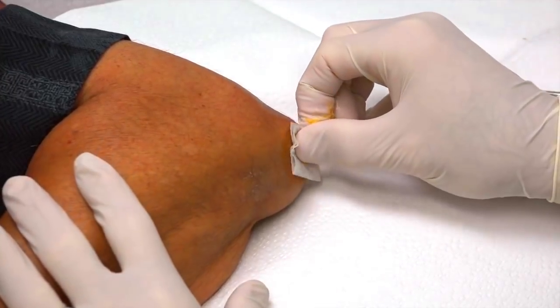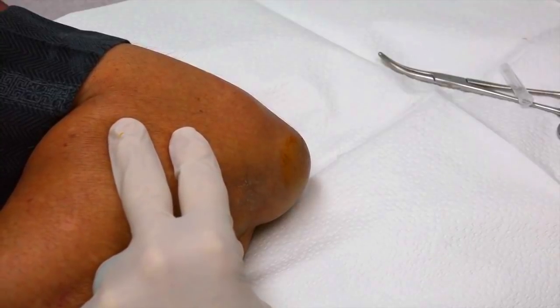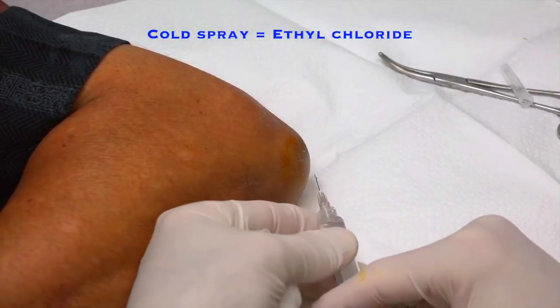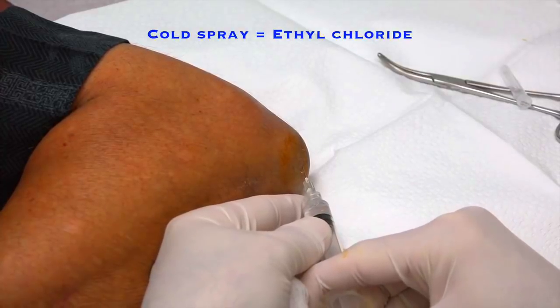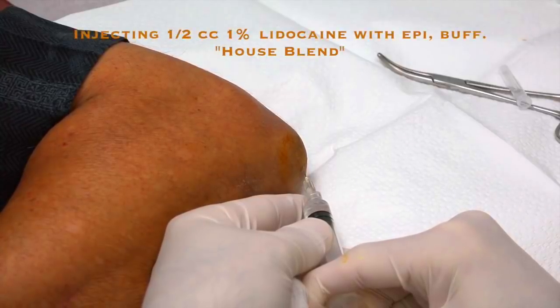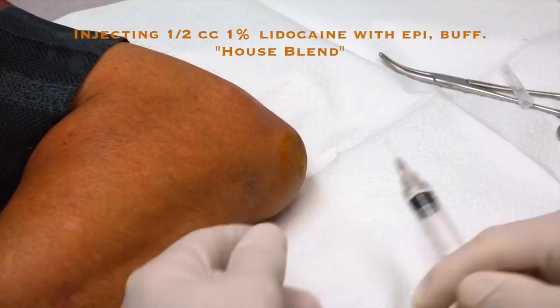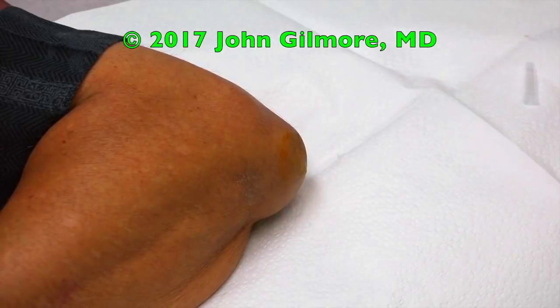Staying active is important, right? Well, we want to do our best to help you stay healthy and active. We're gonna spray a little cold spray on here and go ahead and do the numbing medicine first. We do want to give you a little numbing medicine because we don't want to hurt you. I don't think it feels comfortable when somebody jams an 18-gauge needle into you, so I kind of feel like it probably hurts you too.